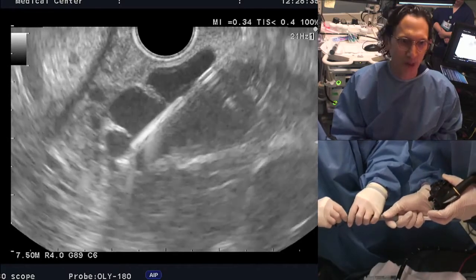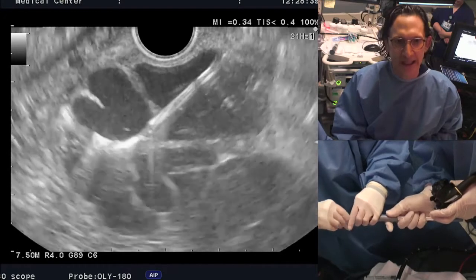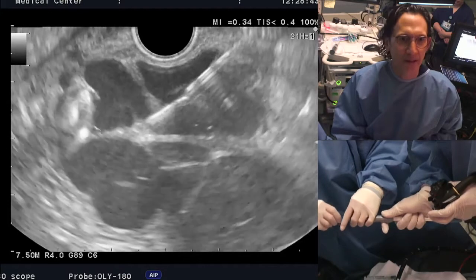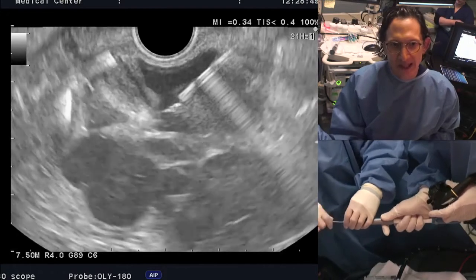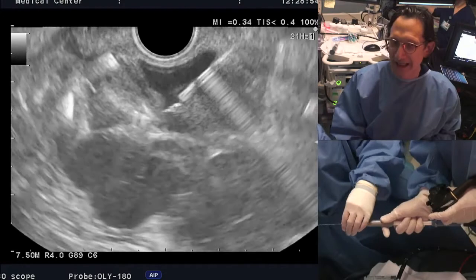All right, let's just put the coil out because we don't want to waste too much time. Otherwise, it'll get really sticky. It's pushing out. You see it. It's beautiful. Very echogenic. There's no problem seeing these coils. There's coil number one. Now, because these are so big, I'm going to have our assistant insert a second.